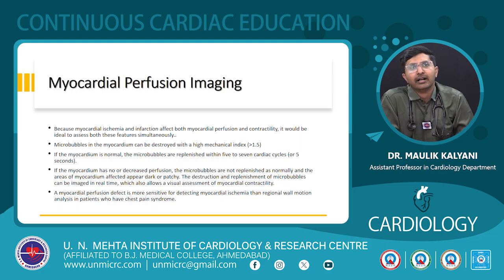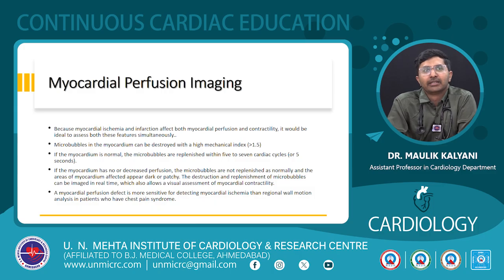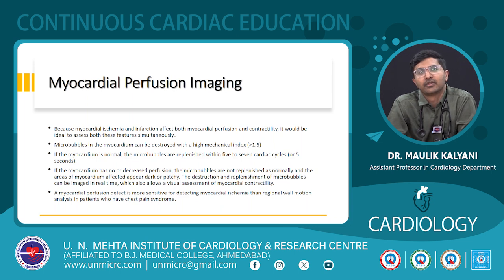This is a topic which has evolved a lot, but because other good imaging modalities are available, like nuclear imaging, perfusion scanning with technetium and thallium, and also cardiac MRI, its use is not seen practically on a day-to-day basis. So we will just go through some understanding and the physics part of it.